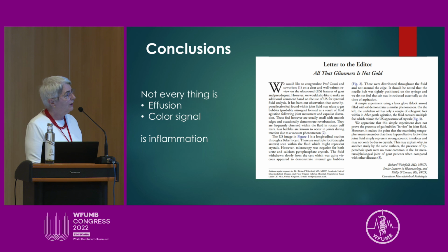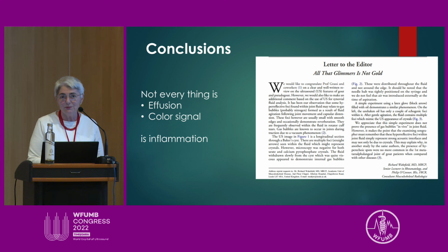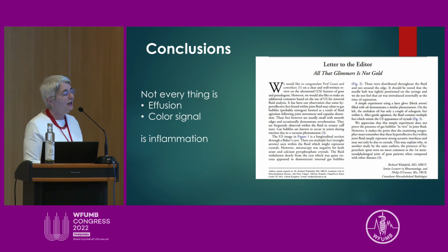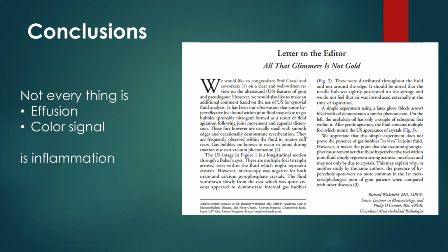To conclude, I come to this letter to the editor published a few years ago that I like very much. Richard Wakefield from Leeds, a very, very nice person, had a patient and found some hyperechoic spots inside the Baker cyst, and said these for sure are microcrystals. But he proved that there was a gas bubble related to a vacuum process, a very nice explanation. And I liked very much the title of this letter, All That Glimmers Is Not Gold.